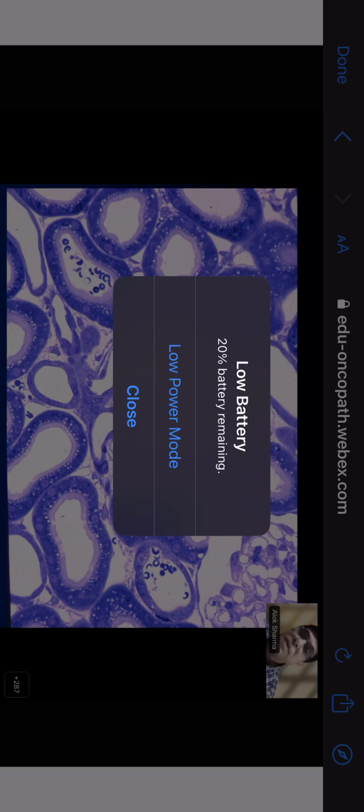So we've looked at the visceral epithelial cell, we've looked at the glomerular capillary, now we've looked at the endothelial cell. And this particular area is the mesangial matrix. So that is where the anchoring of all these capillaries occurs. So the mesangial matrix forms a matrix network where all the capillaries are hinged, basically. So this is a very important area where a lot of immune activity and other things happen. So this is the mesangial matrix, and those two nuclei which you are seeing there are of the mesangial cells. Okay. Now go to the periphery.